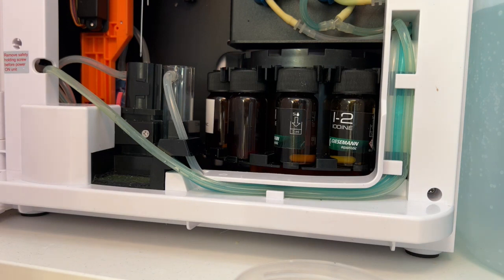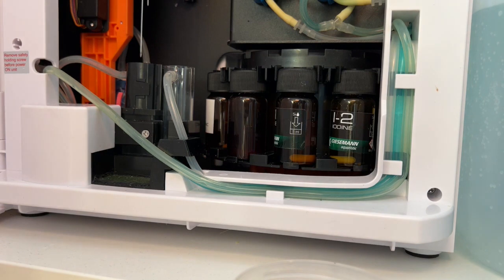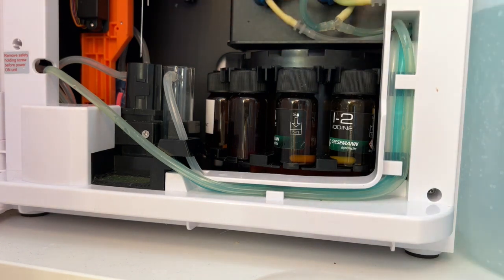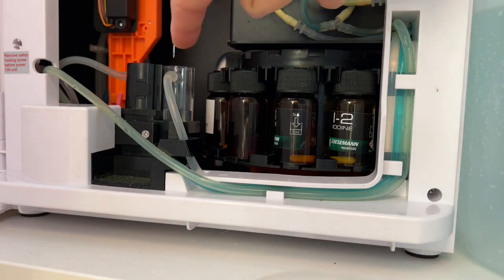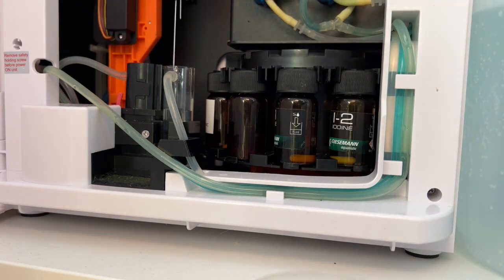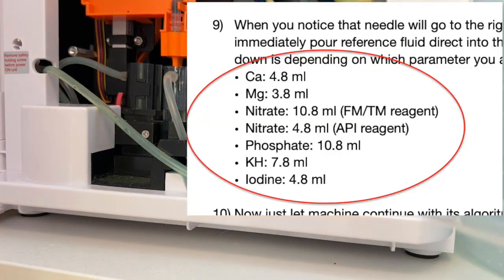Do not fill up again. You will hear some rattling because the reaction chamber is empty — that's normal. The empty motor starts and it will just be air. Then you will hear the A motor starting and filling the rinsing chamber. Now you will see the needle going to the rinsing chamber. At that point, pour down the sample volume into the reaction chamber — check the PDF for the correct volume depending on the parameter and reagent.